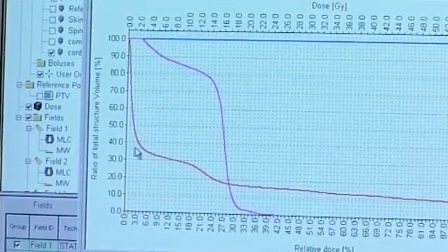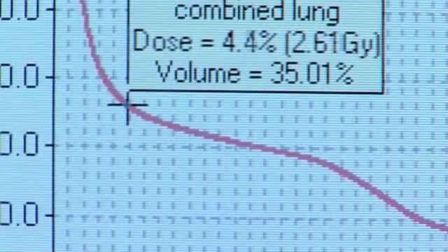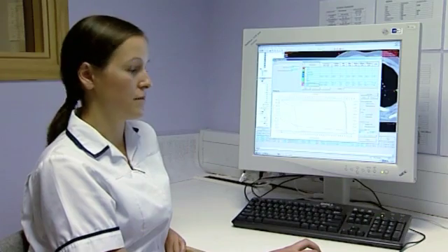So looking at this graph, we can see at the 35% level, the dose to the combined lung is only about 4.5%, which is very good.